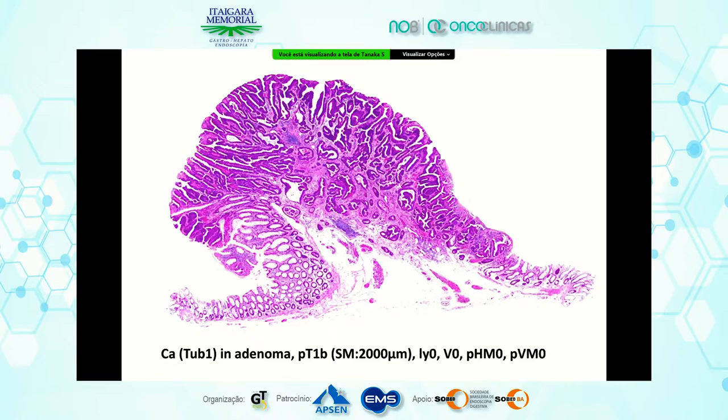When we diagnose carcinoma in this region, we have to do EMR or ESD. We should not do polypectomy. Carcinoma shows invasive potential, so we have to get enough submucosal layer tissue, so EMR is important. If we conduct polypectomy, the cutting edge is like this and the deep margin is positive.